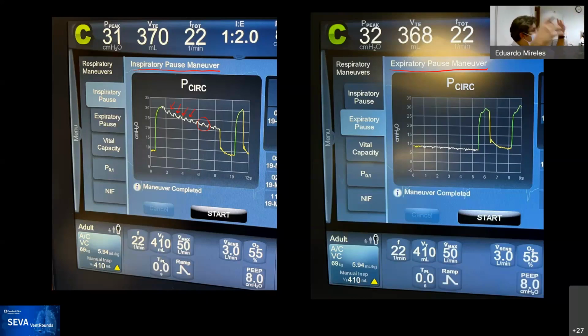So as that's increased, it creates oscillations on the airway, on the floppy area of the airway, and that's what gives the oscillations. So if you inflate the balloon better, now you have more opposition against the structure, and you're going to transmit the oscillations better. Nobody has proven this, but this is a theoretical construct for it.